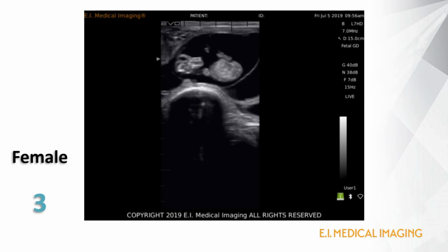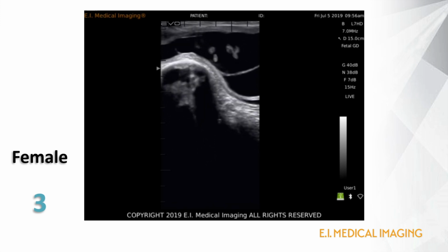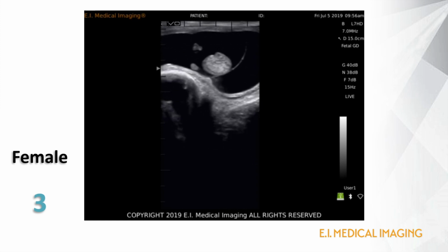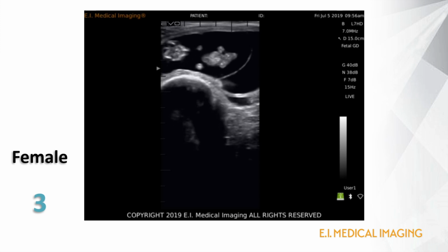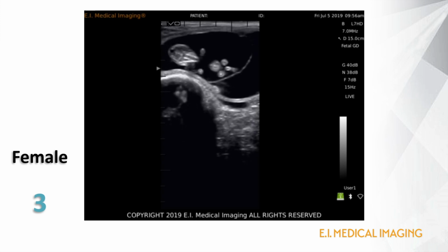Making this one a tad trickier, the fetus appears to be a little more curled up, with the pelvis tucked in and the tail between the hind legs. However, by slowing down and scrubbing through, we can see that the GT has moved toward the hind end and is separated from the umbilicus and near the tail. This is a heifer calf.